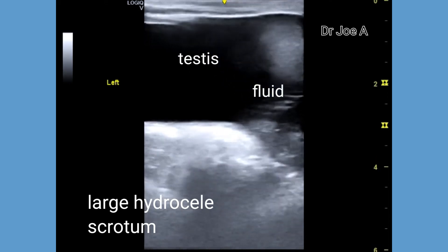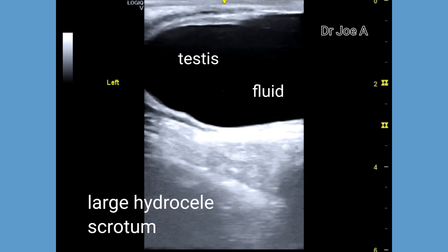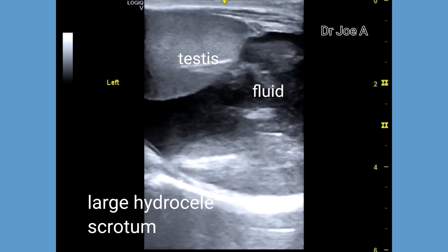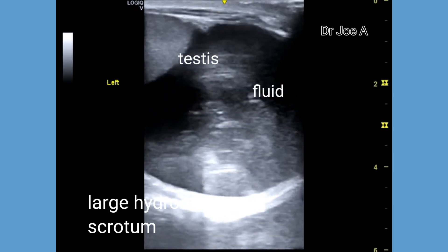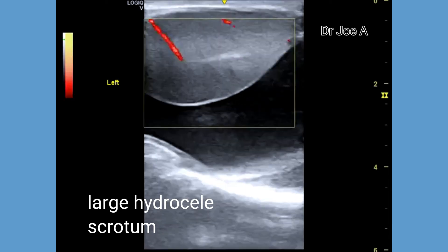On ultrasound, there is an anechoic fluid collection extending from the upper pole of the left testis all the way almost completely around the testis to the lower pole of the same side.